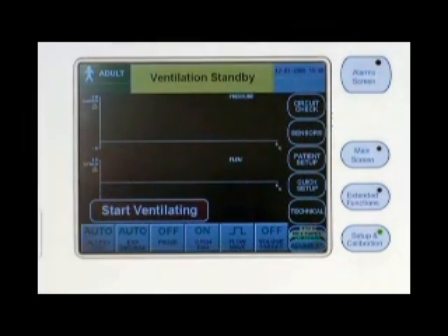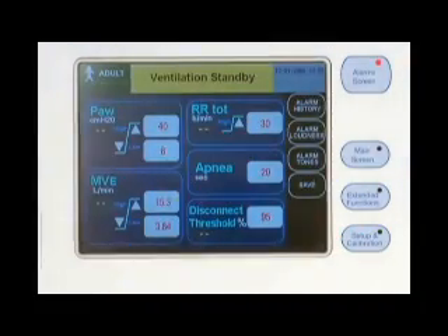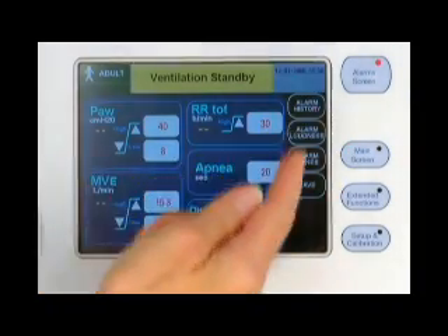There are four menu buttons associated with the graphical user interface. The alarms menu button brings up the alarm limits screen, which has sub-menu touch buttons for accessing the alarms history, accessing the alarms loudness selection screen, accessing the alarms tone selection screen, and saving the screen image to memory. All of the other three menu buttons bring up the last graphic you selected while in the main screen menu, but with a different set of sub-menu buttons.